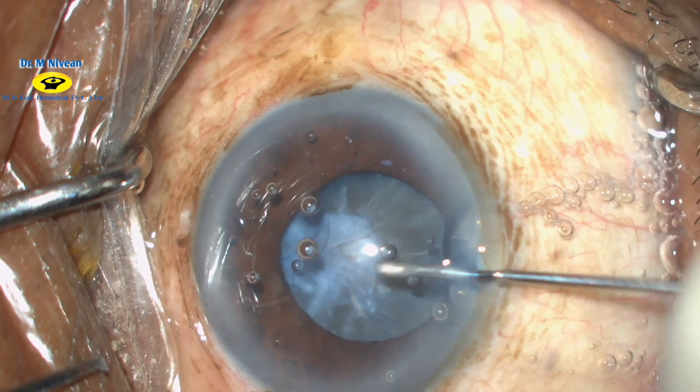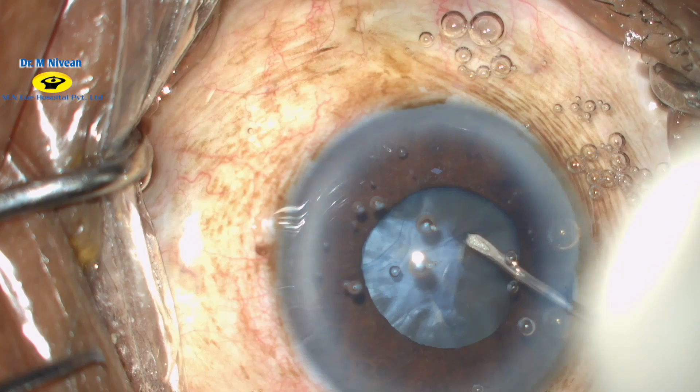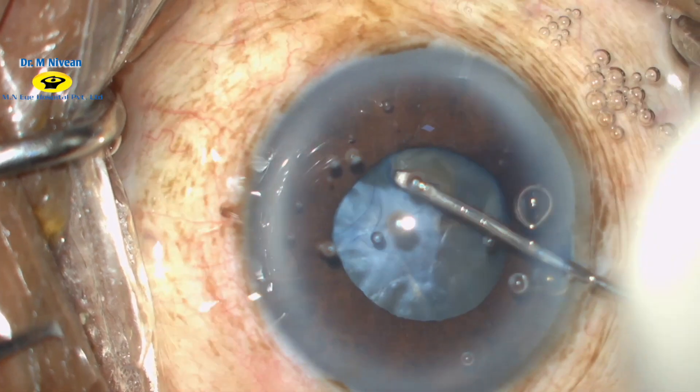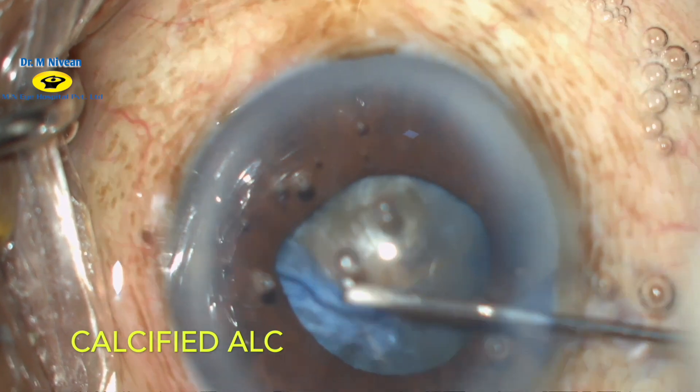The cystotome needle is now used to initiate the capsulorhexis. As you can see, there is a difficulty encountered in tearing the anterior capsule, so we preferentially avoid that area. Now the capsulorhexis is initiated and the triangular flap is folded.